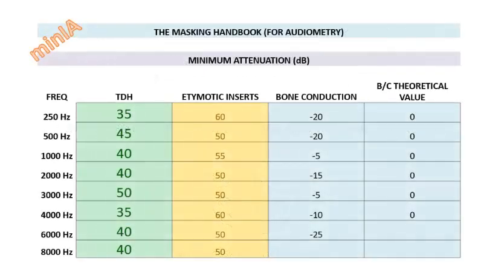Here are our minimum possible interaural attenuation values as taken from the various studies that have looked at IA. We know these are extreme values, the least attenuation that is known to occur for the various devices at the various frequencies. We use these values to make decisions during audiometry and masking for all our test subjects. But we also know that most of our subjects actually have higher attenuation characteristics than what we see here.